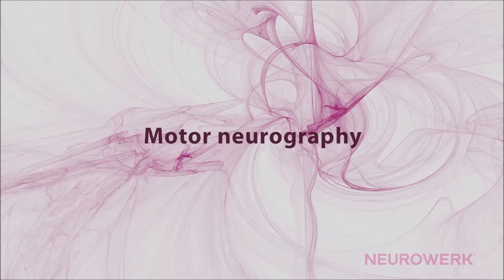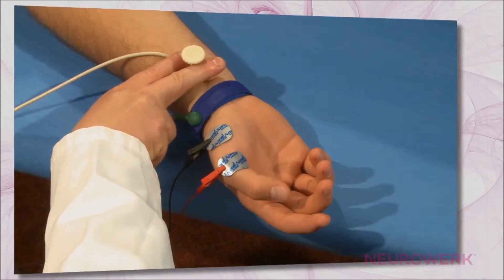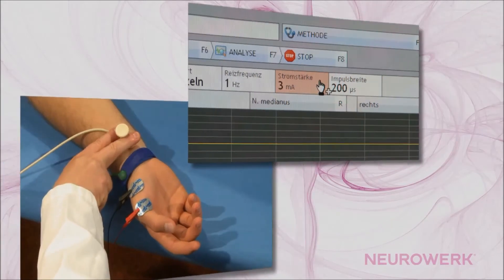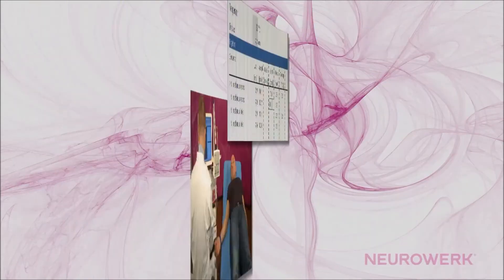Motor Neurography. The performance of motor neurography is basically equal for all nerves available for this examination. Therefore, it is recommended to first analyze the examination using the median nerve as an example. The techniques shown and described herein are essentially repeated in all other nerves, especially regarding the basic application of stimulation and recording electrodes, as well as the method of distance measurement.